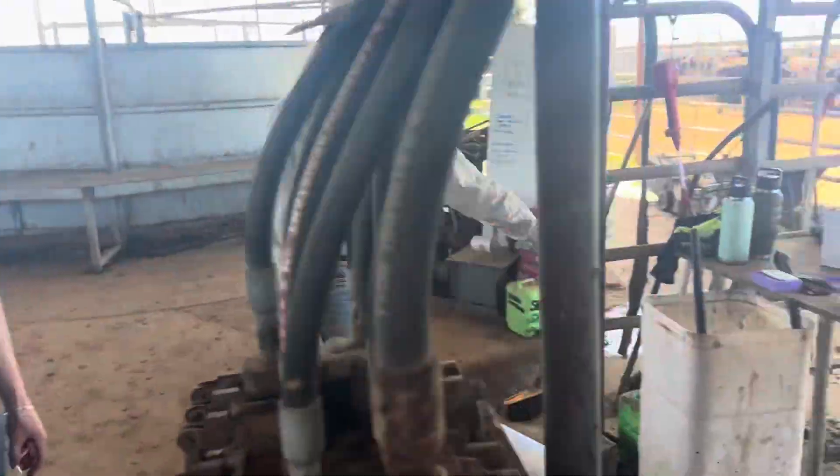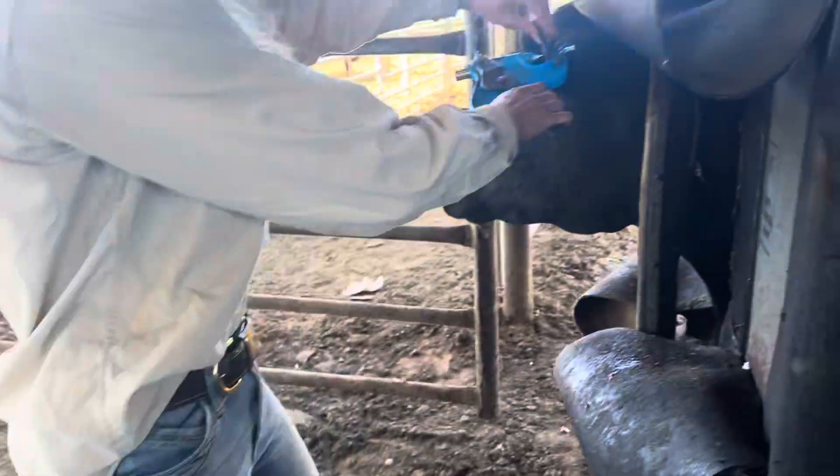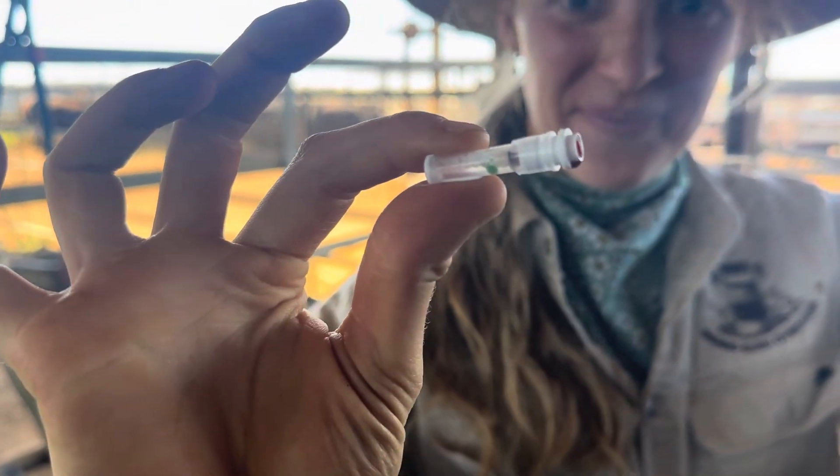We've got to take a DNA sample, so we're checking the mother. This is her parent verification. So that's what the devices look like. Here's Emily taking a punch. Punch. Did the little ear, leaves a little hole inside there.